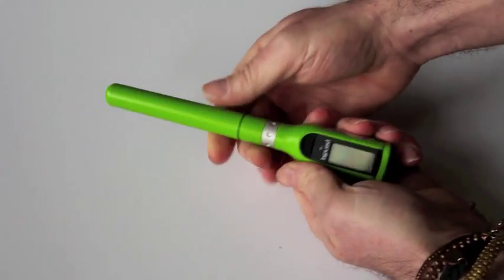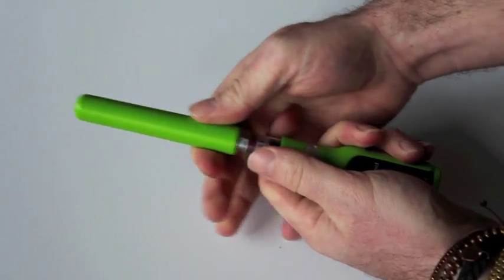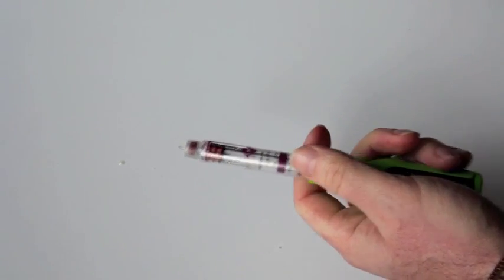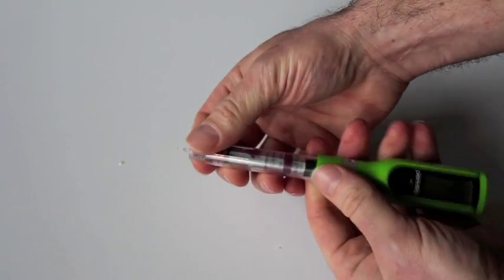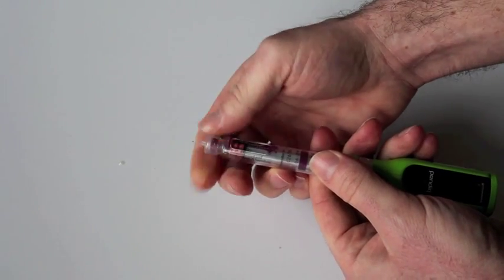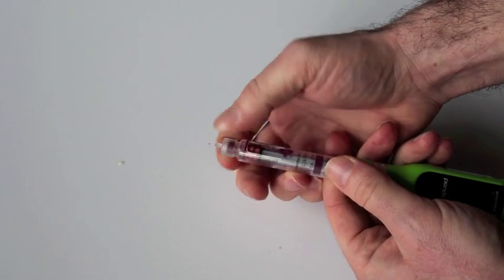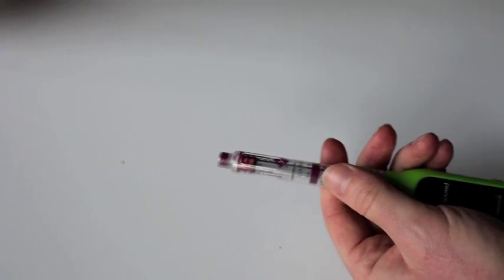First of all we've got to pull off the cap. I'm going to pull the cap off here carefully because obviously there's a needle in there. Now we're going to take the needle off — just unscrew that — and you should put this into a sharps container or dispose of it properly.